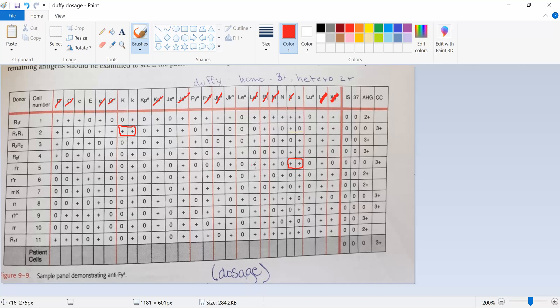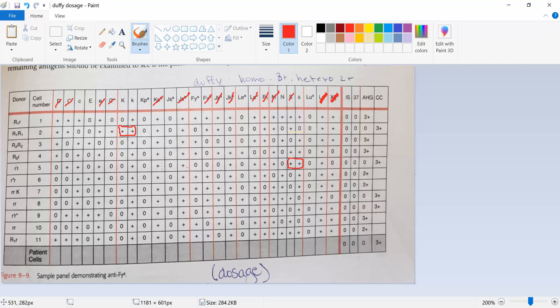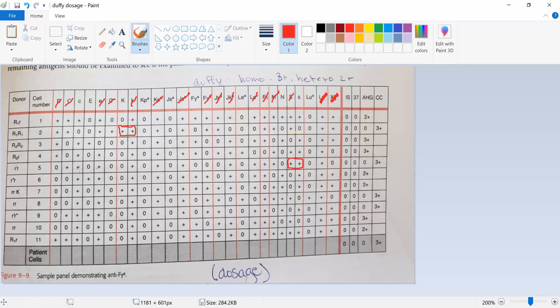And that's another thing I try to do to myself when I'm going across these to not only, you know, it's given me LEA and LEB, but to think in my head, what's the actual name of that? Just a little more reinforcement. So JKB, Kidd? Mark off Kidd B. I already got that one marked off. I already got KPB marked off. Kel, or Solano, can I do Solano now? Yes, now I can mark off Solano because it's homozygous. Little E's already marked off. Little C, can I mark off little C? No, it's hetero. Yeah, it's heterozygous, so we'll leave that one for now.